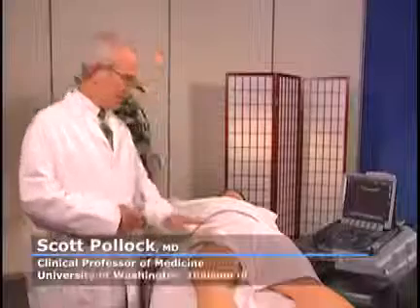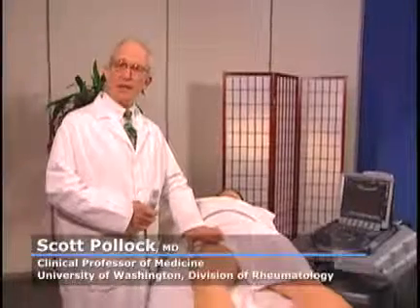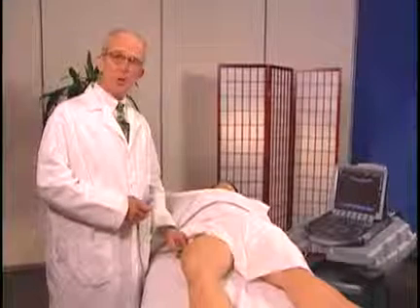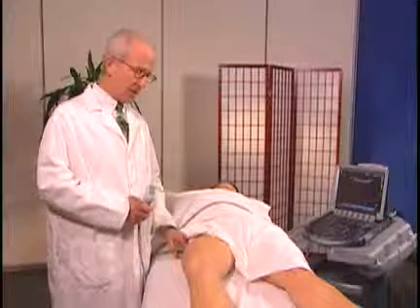We're going to examine the hip today. This is her right hip, and we'll look anteriorly at the femoral acetabular joint, and then we'll also look laterally at the greater trochanter.